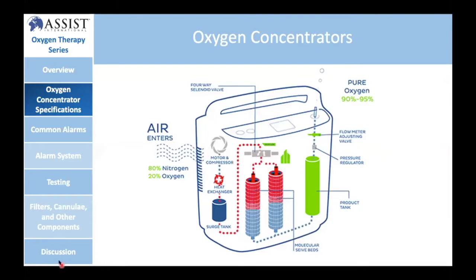So you see now, the same picture. In this process, there are so many things that can go wrong. For example, the external filter could be blocked and no air may come in. So in that case, you expect low pressure to happen, and then of course that's a malfunction. Then you'll hear some alarms. Or for example, the flow may be blocked, or there could be high or low pressure, which is beyond the range. And those things are associated with alarms that my colleague will go through later on.